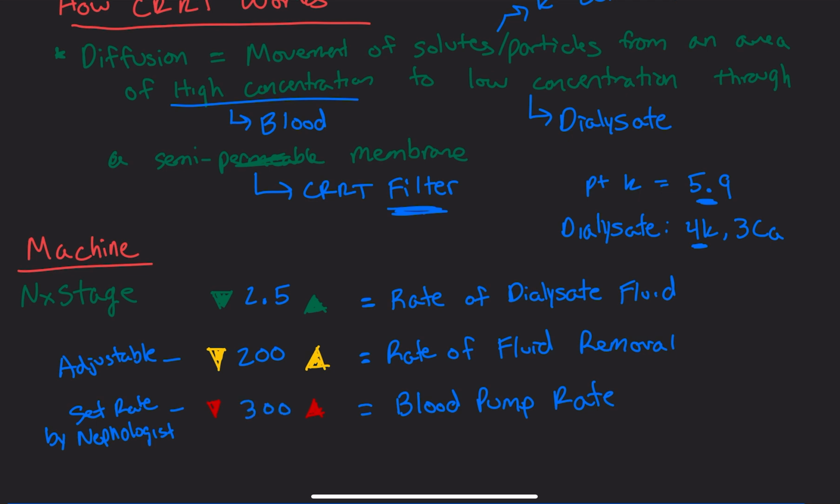As far as calculating this rate, when you have CRRT, it's very important that you are on top of your I's and O's, and calculating how much is going in every hour. Typically you will get an order that may say, let's say your goal is even to negative 50 mLs an hour. Let's write this out over here.